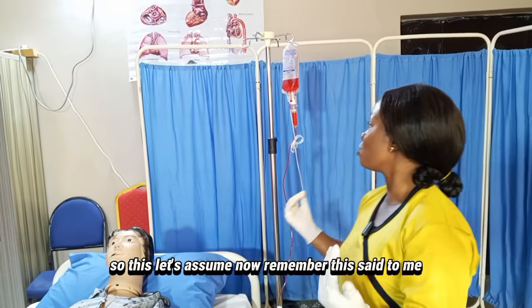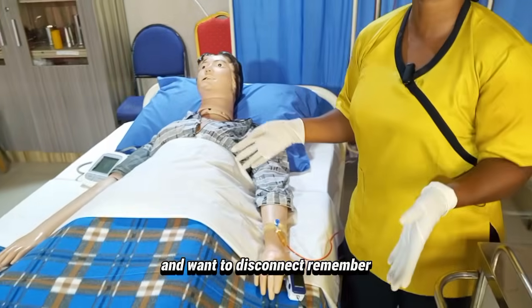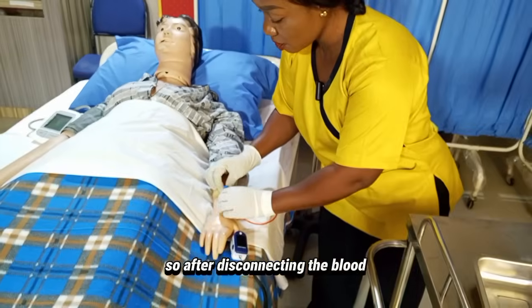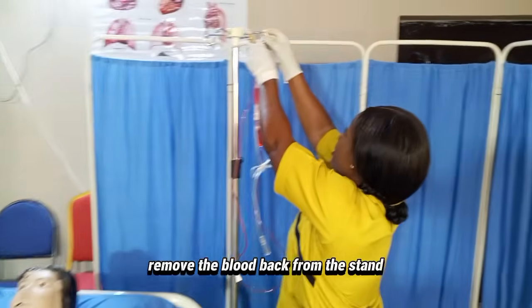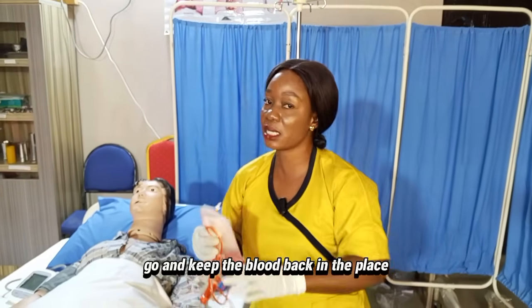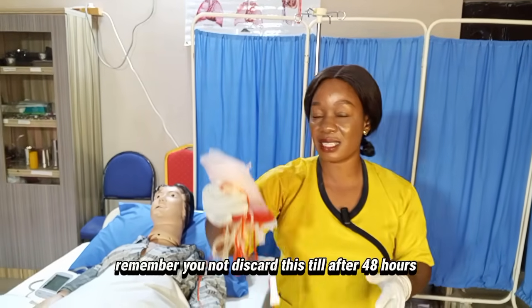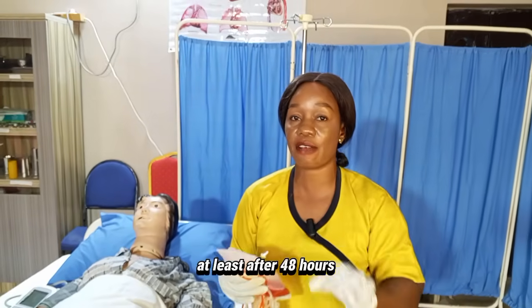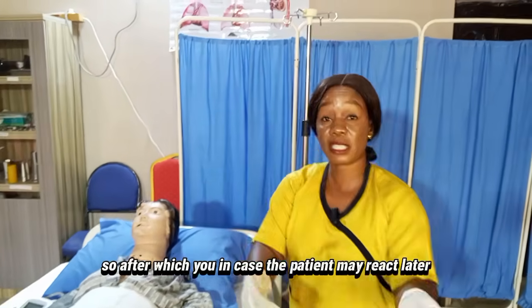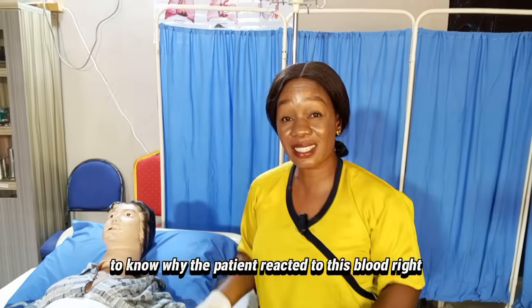Let's assume the blood has finished. After disconnecting the blood, remove the blood bag from the stand and keep it in the appropriate place in the ward. Remember, you will not discard this blood bag until after at least 48 hours — in case the patient reacts later, you will have the blood product to send to the lab for testing to find out why the patient reacted.